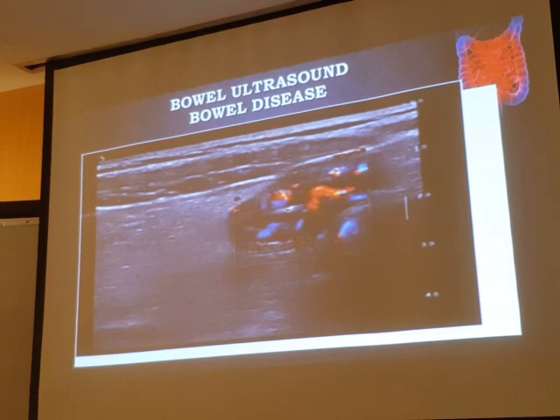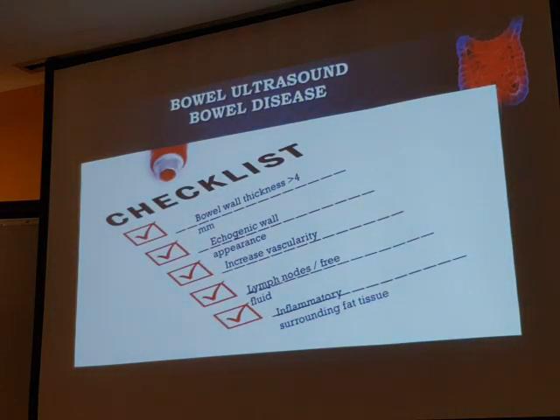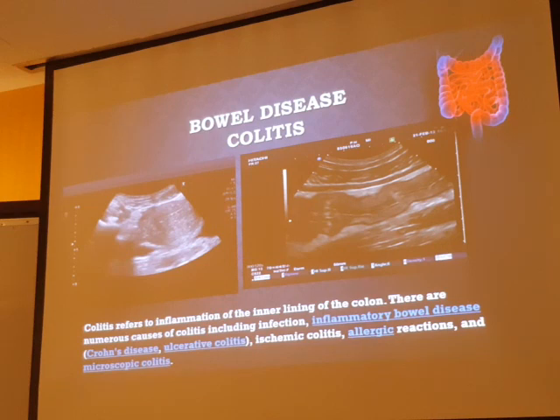Once I collect this information, no radiologist will argue with you. You have all the information to prove that you have inflammation, bowel disease. This is all the information you needed to collect. So let's go to the colitis.